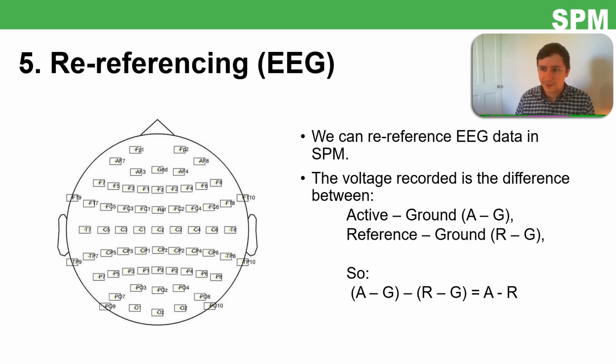Right. So this is a bit of a change in pace, but let's talk about referencing and re-referencing of EEG. Practically speaking, this is all very easily handled in SPM. So you should know what the online reference was, and I'm going to talk about what that means in a moment, but you should know what it is, and you should decide whether you're going to re-reference to some other scheme or montage.